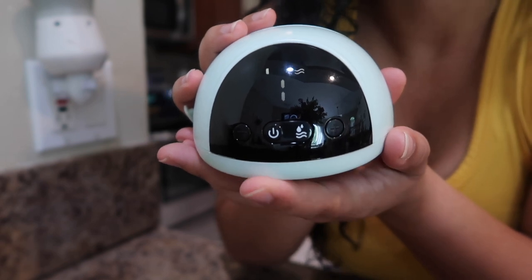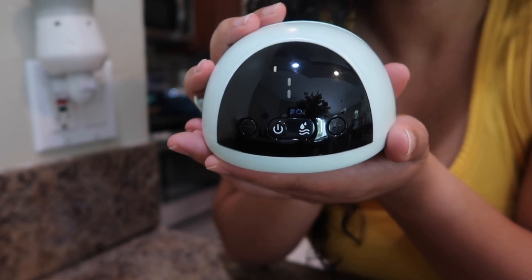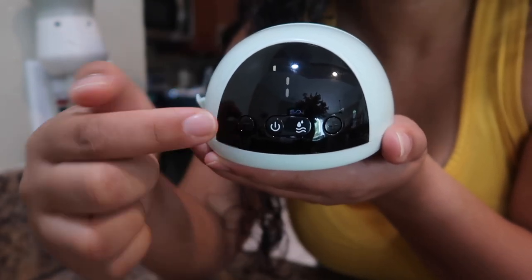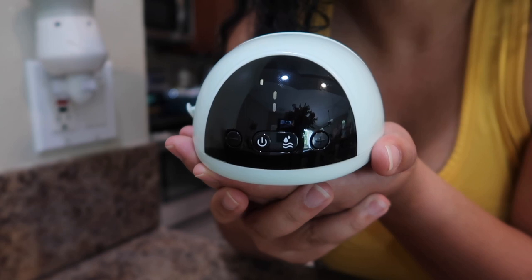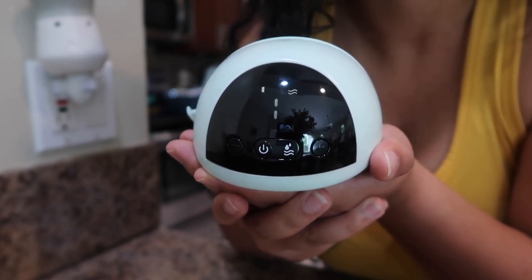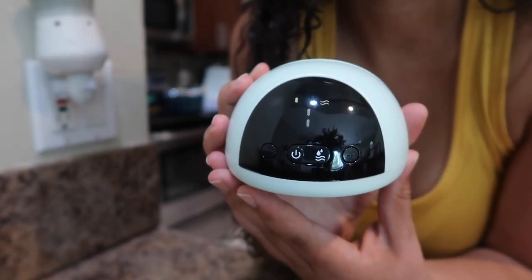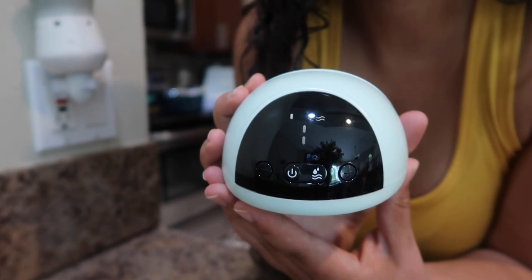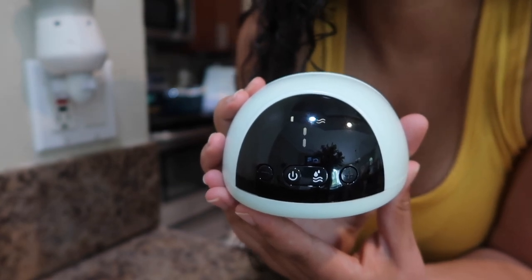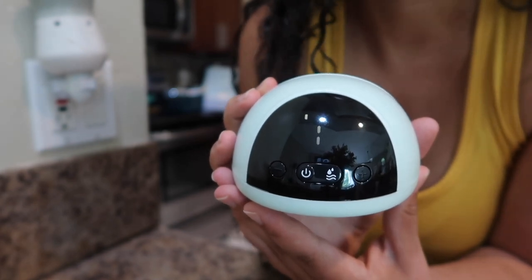It has an LED screen that will lock after 30 seconds of using, and it also has 9 vacuum settings that you can adjust with the button right here and right here to turn it up and down based off what is most comfortable for you and what works most efficiently to get the milk out. There are also 3 modes, which is expression, stimulation, and the two-phase mode. I'm gonna use the two-phase mode, and I think I'm gonna put the vacuum settings around 6 or 7, and I'm just gonna see how it feels and if I need to turn it up or down.